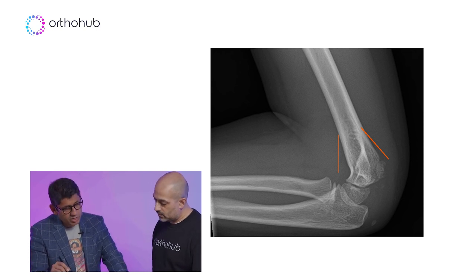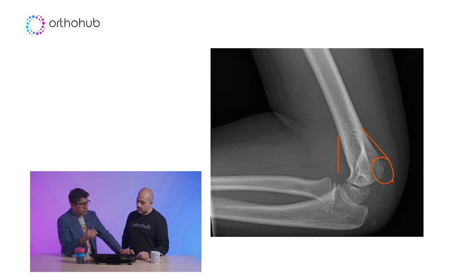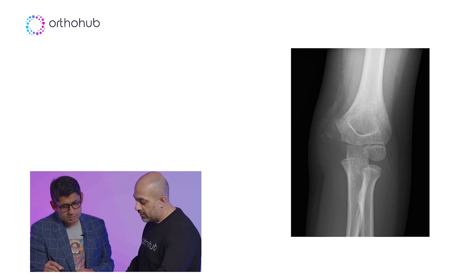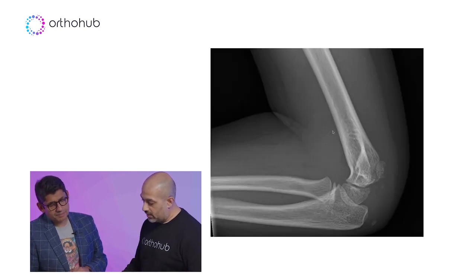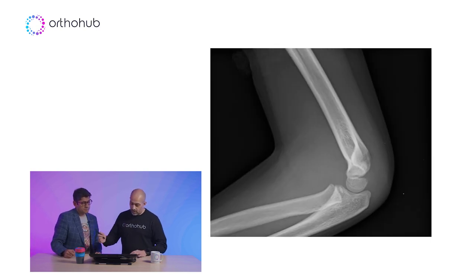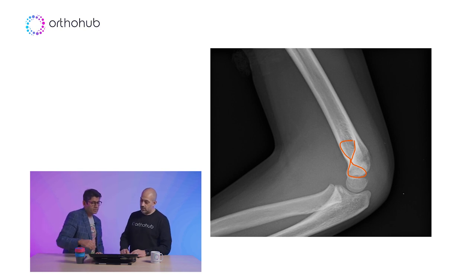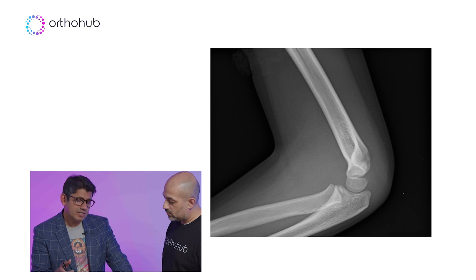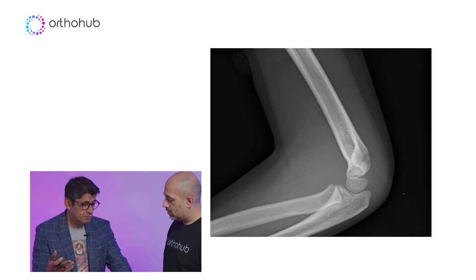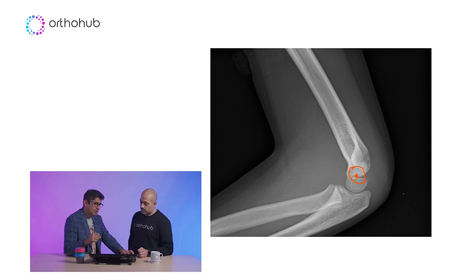The other thing to say is that's your medial epicondyle - and when it displaces, it displaces usually anteriorly. So here you'd be looking at this body in the olecranon fossa thinking, well, what's going on there? Always be suspicious. And just matching it to the AP, you were concerned about something around here anyway, which just gives you further ammunition to suspect something there. Regarding the hourglass concept - that figure of eight is what you want to see. When you're doing your supracondylar fractures in theatres, that's really important. In real life you're not going to send a child back just to get a true lateral, but when you're making decisions and especially in the operating theatre, you want to see this because that's where your wire is going to go.